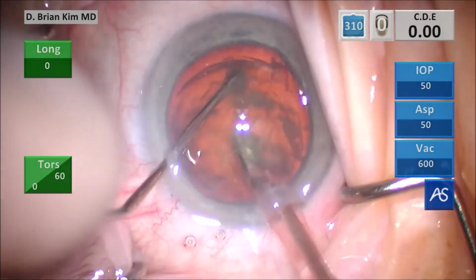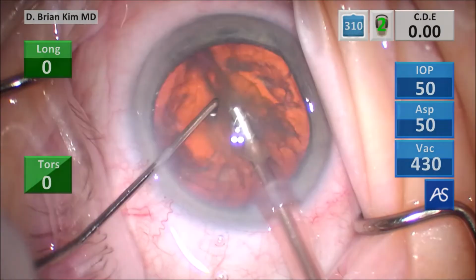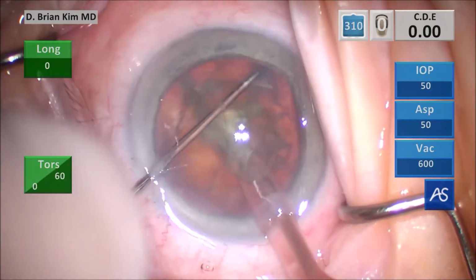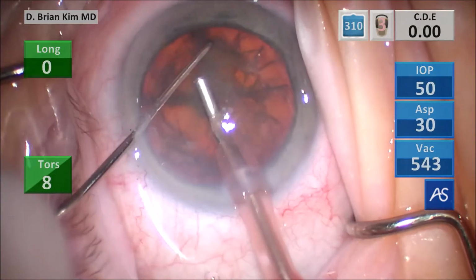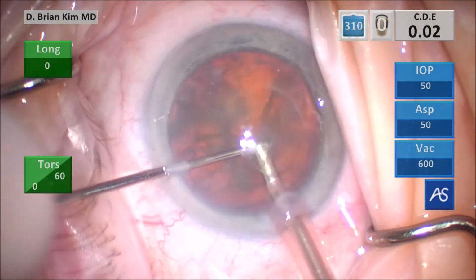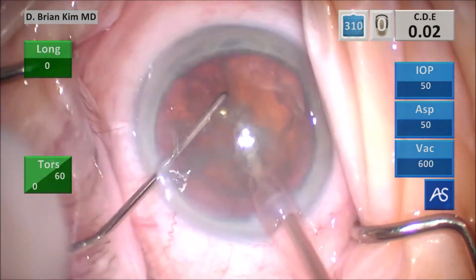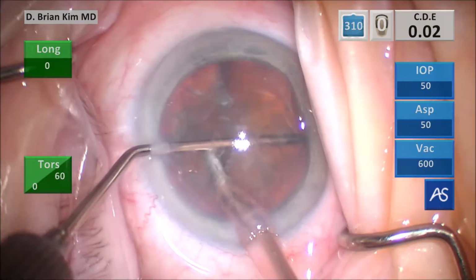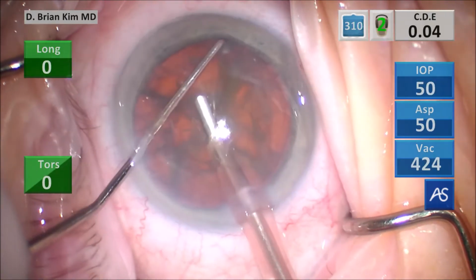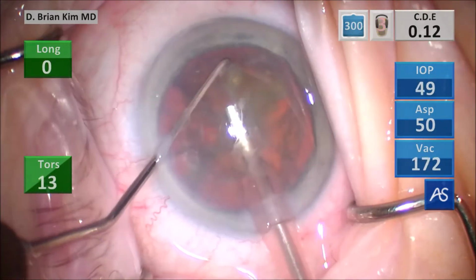pointing the phaco tip vertically sub-incisionally, bisecting the lens in half, placing the chopper around the right heminucleus, pointing it centrally, pulling it centrally towards the phaco tip, and that should divide the right heminucleus. The chops were not that clean, again because of the sticky nature of the lens and perhaps because of the loose zonules. I rotated it and then did the same maneuver, and then I did the cross chop on that right side heminucleus. Lift that first quadrant with some vacuum and then emulsify the lens pieces.